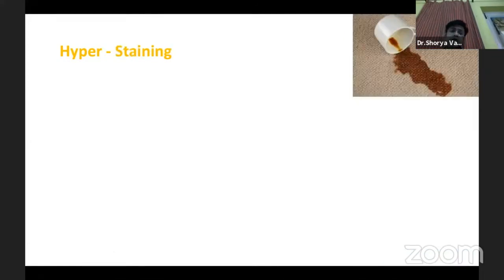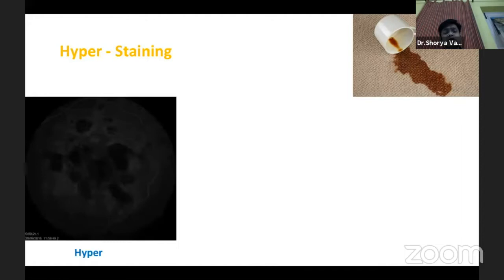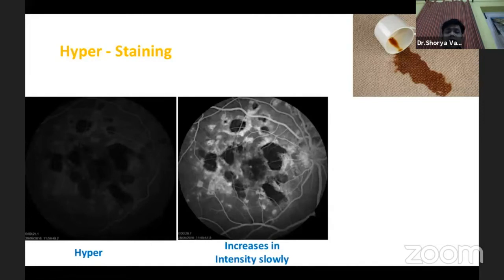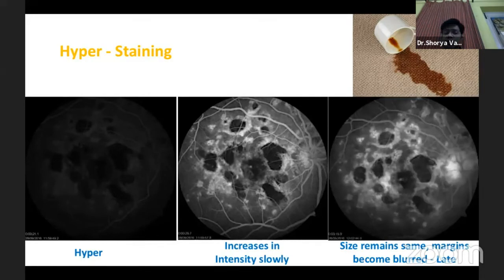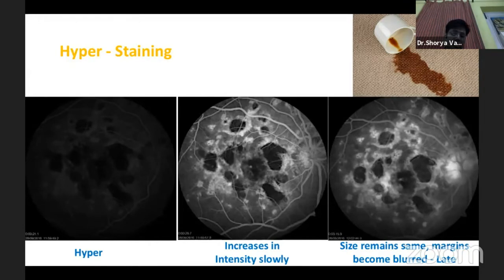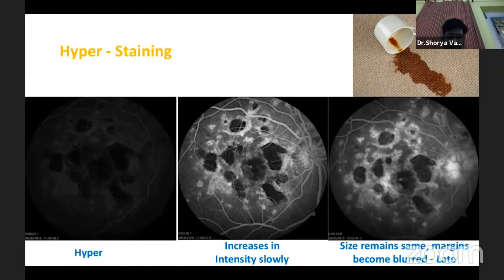The next type of hyperfluorescence is staining, where there is slight hyperfluorescence that slowly increases as we go along in the late phases and more so in the recirculation phase. The size remains the same but the margins might get blurred, and you can typically see the disc staining in the recirculation phase. These are more commonly seen wherever there are scars, such as in histo choroiditis or old choroidal neovascular membranes.